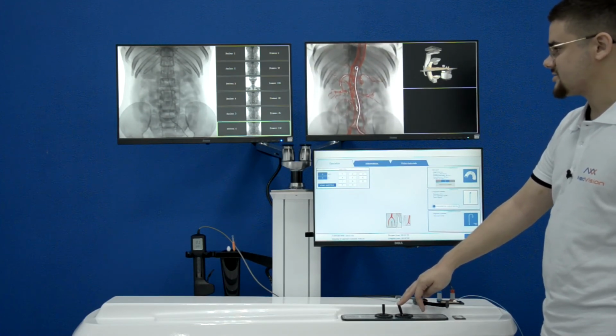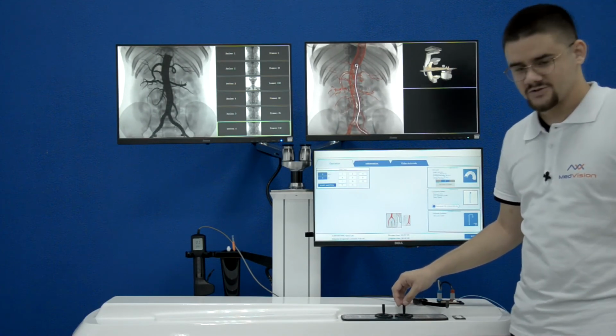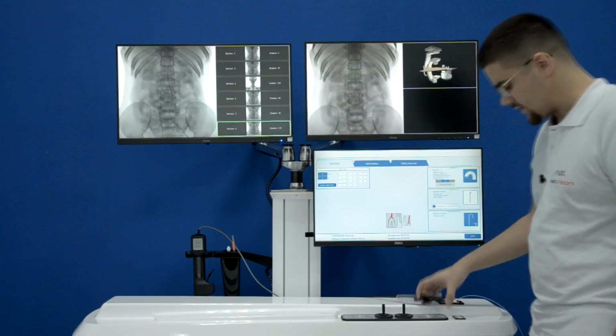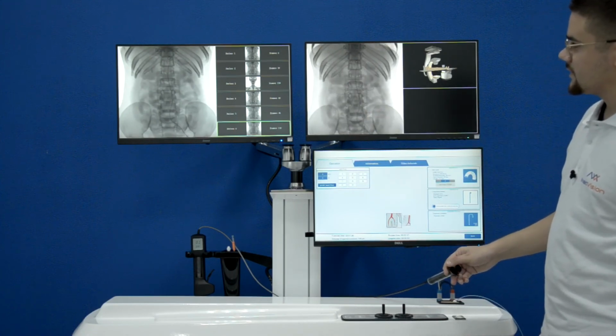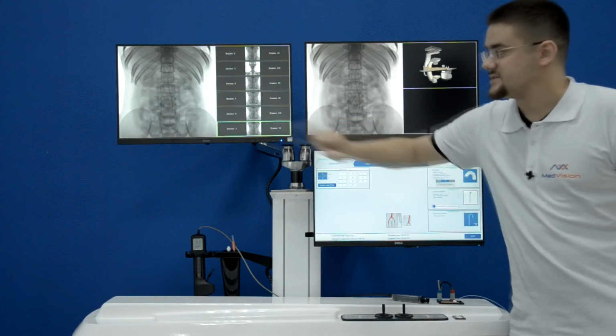For generic endosurgery modules, we try to take more standard and common ones. For the rehearsal modules, we try to choose more complicated ones. Here we want to show you how, for example, the contrast is going to look on the left screen. The frame rate and the quality of the picture is very nice. You can see it here.